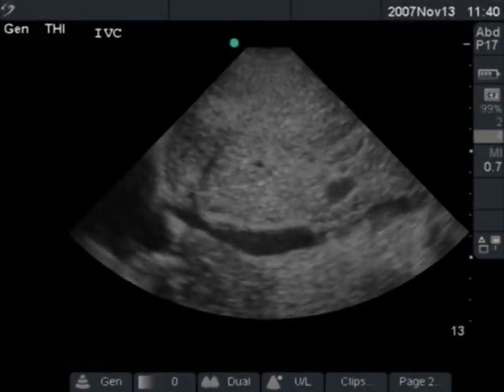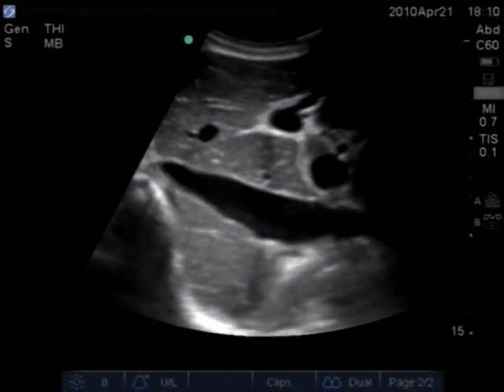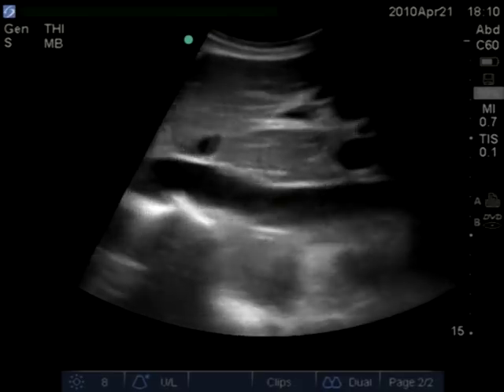Another patient who has near complete — certainly greater than 50% — collapse of their IVC with respiration. Patient needs fluid. We gave that patient two liters and looked at the IVC again. It's bigger, but it's still collapsing greater than 50%. More fluid is needed.